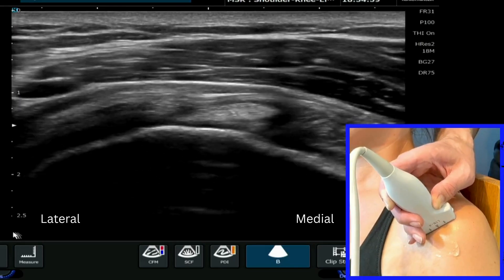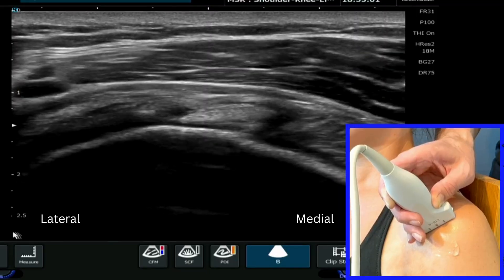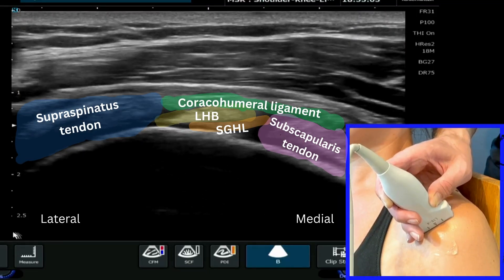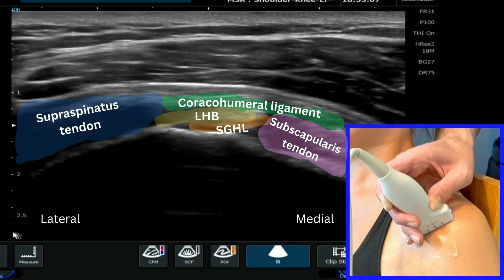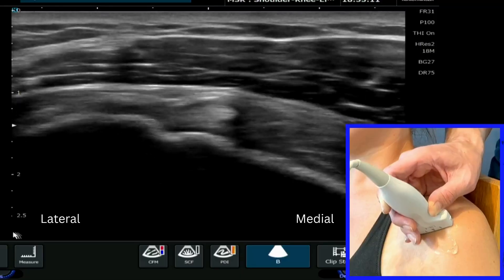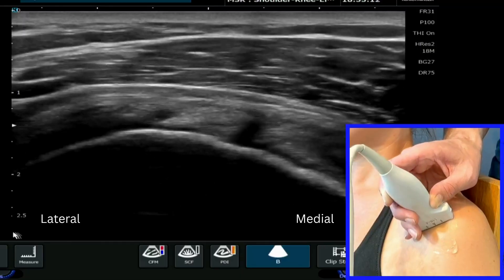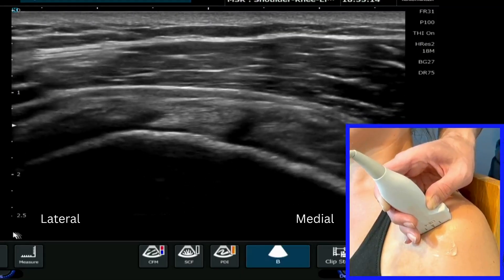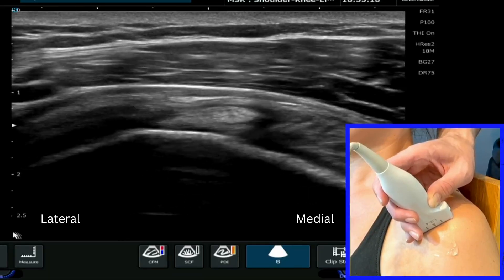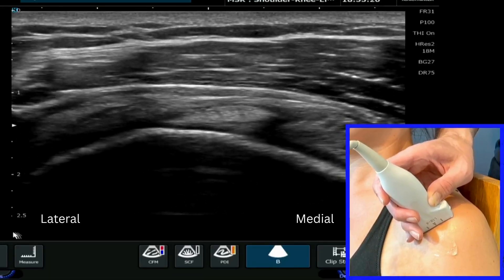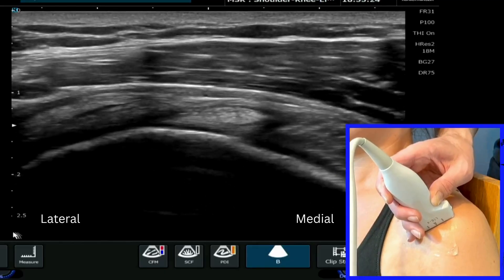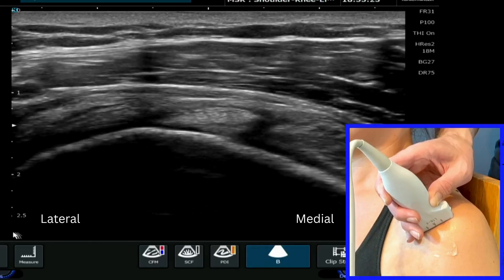So this is the region that we call the rotator interval, and this is how we find it on ultrasound. Just be very clear on the changing angulation of the probe as you come up facing much more medial towards the neck to then see those structures, and fishtailing to try and bring them all into view nice and clearly.